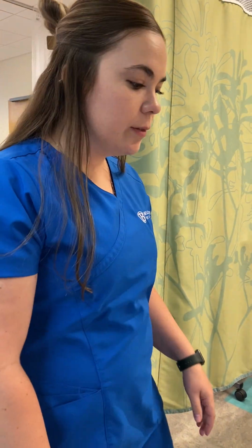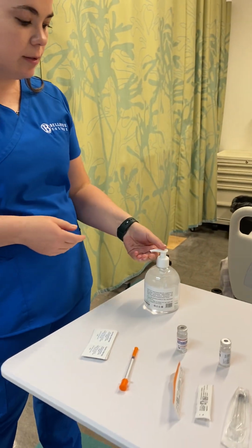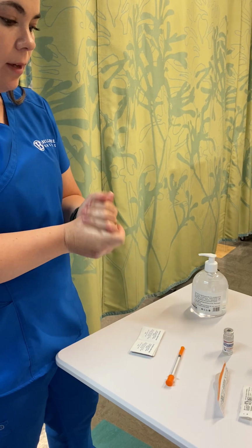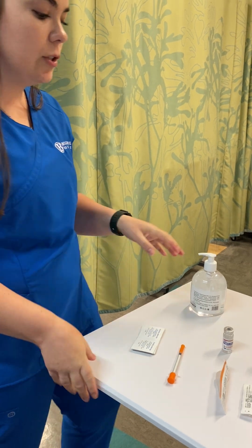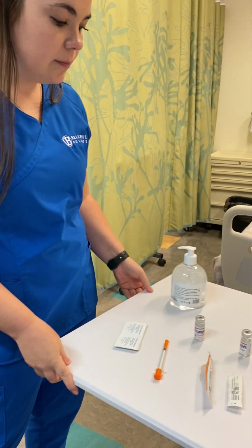Okay, so outside of our patient's room, we'll be in the medication room. We'll be drawing up the medications. I'm going to perform my hand hygiene. I would look up the patient's MAR to obtain the right medication that I'm going to be administering. It'll be the flu shot and their insulin.